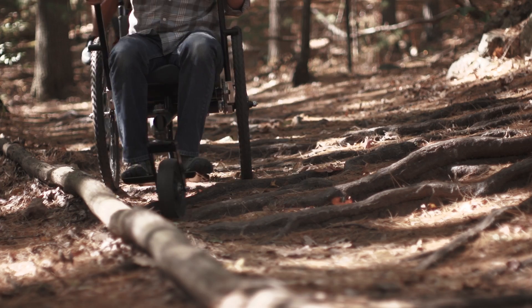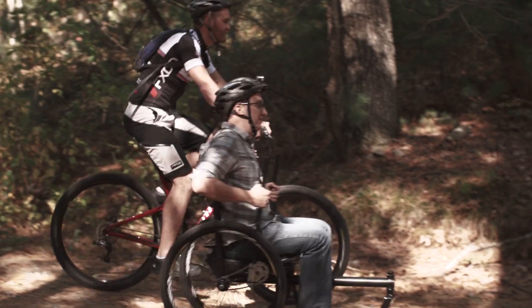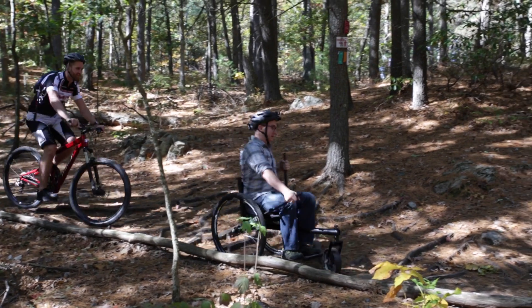All the moving parts on the Freedom Chair are bicycle parts, from the headset right in the front wheel down to the 26-inch downhill mountain bike tires we use in the back. This means you can roll into your local bike shop and get any spare parts you might need. And not only that, but you can customize it and make it your own.